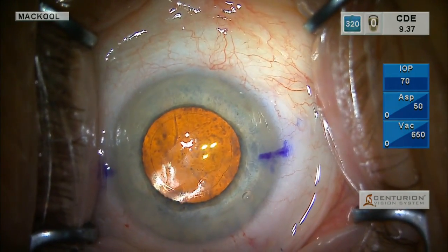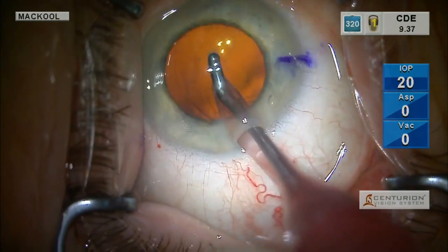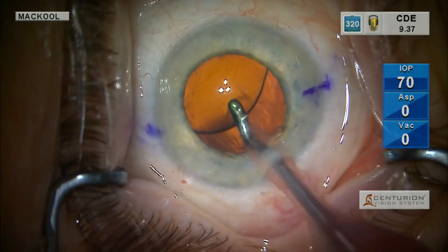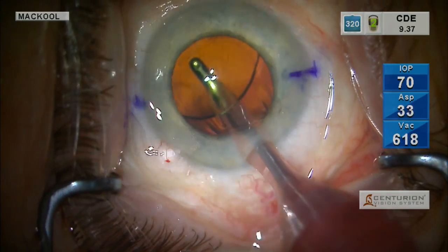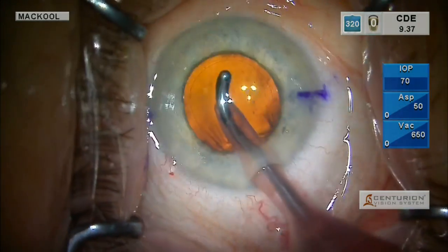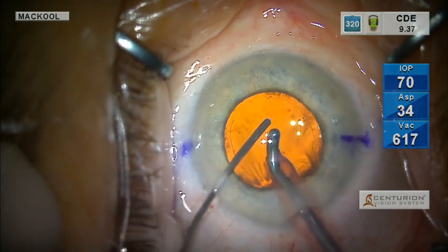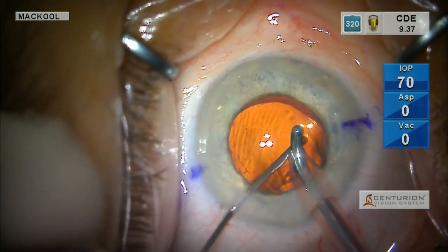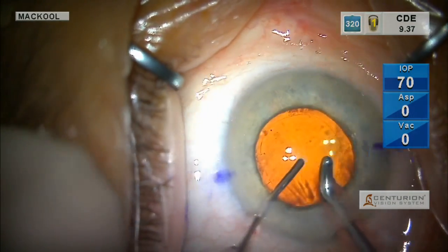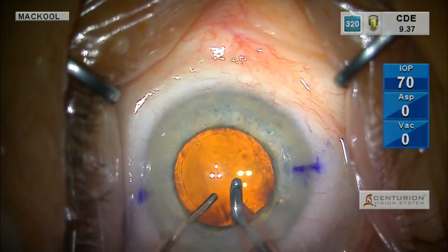You see the epithelium there, a little dryness again. And now we'll remove the OVD from behind and then in front of the IOL before we put it in its final position. The best way that I've found reliably to rotate a toric is simply to put the tip of a spatula at the haptic optic junction. Now you can see what I'm doing is I'm rotating the eye from one side to the other to look in and see that the marks on the toric are aligned properly, and they are.